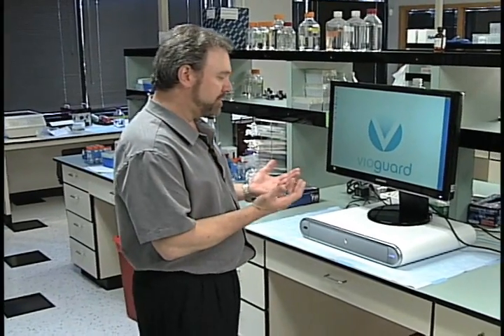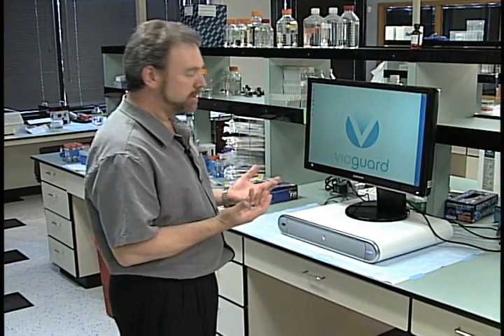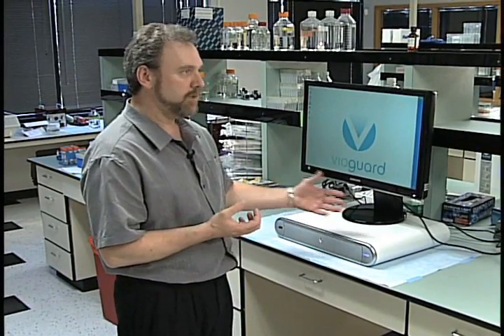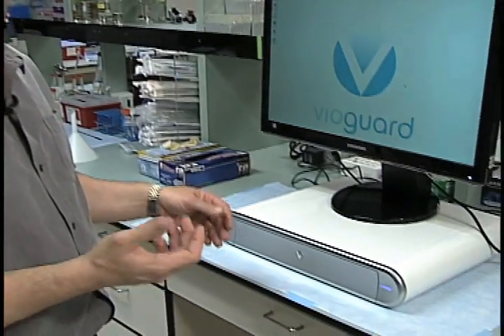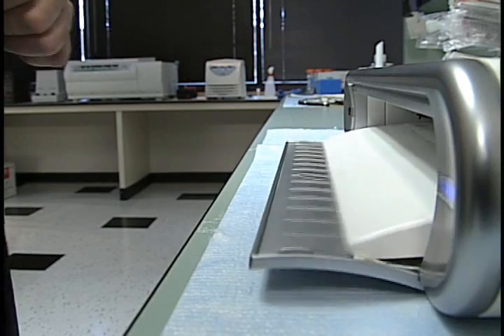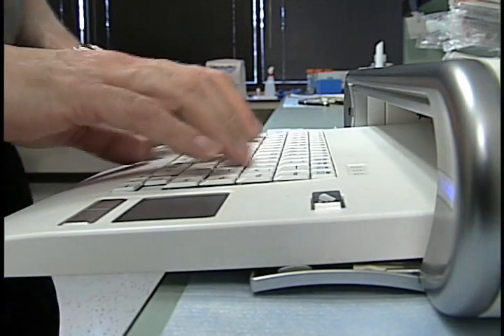As the worker approaches, you have to assume that their hands are contaminated. So we couldn't design the unit with a button on the outside — that would just transfer the contamination point. So we're using an infrared sensor similar to those found in faucets and towel dispensers in restrooms. You just wave your hand in front of that and it presents a fully disinfected keyboard.